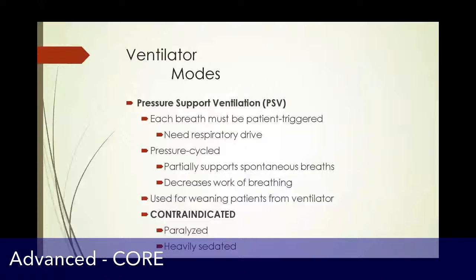but it partially supports the patient's inherent inhalation and exhalation. So you don't have to do all the work. You don't have to work against this long tube in your mouth. You don't have to work against all the tubing of the ventilator. It's going to give you a little bit of pressure, but ultimately it's seeing if the patient is ready to be extubated.